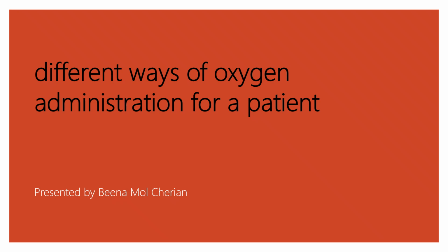Good morning, everyone. Today, let us see the different ways of oxygen administration for a patient. What all are the equipments we will use for the patient to provide oxygen administration? Let's see one by one.